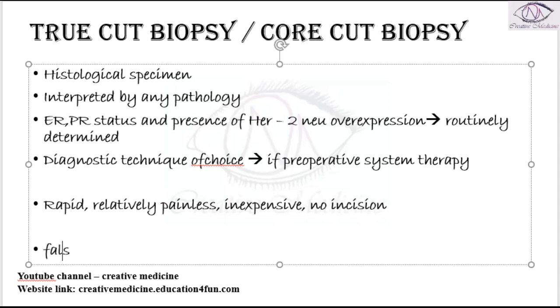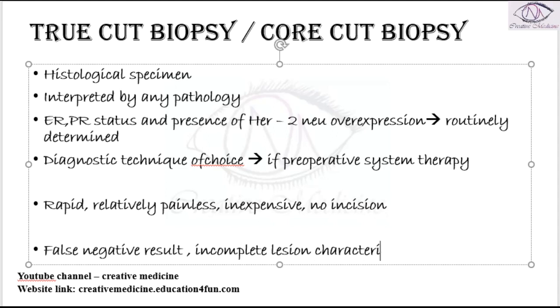Then false negative results can also occur in this. And one more important thing is that incomplete lesion characterization can occur with this true cut biopsy. So these are the main disadvantages: the presence of false negative results and incomplete lesion characterization.